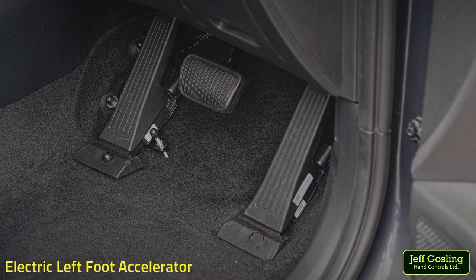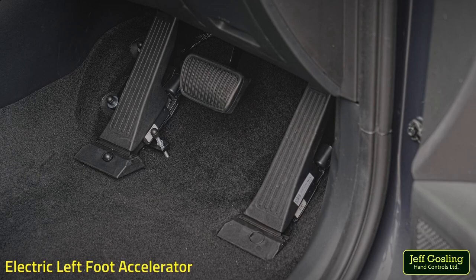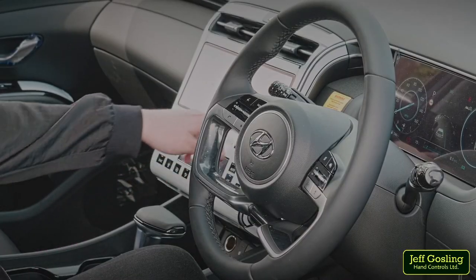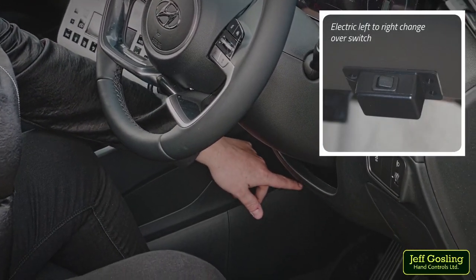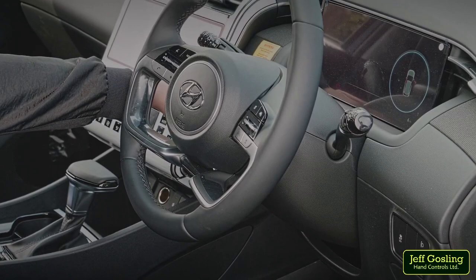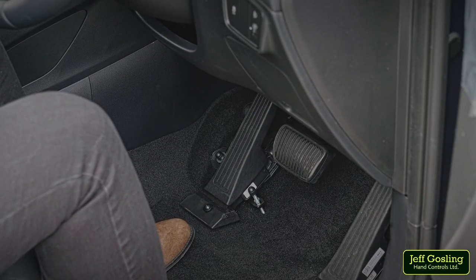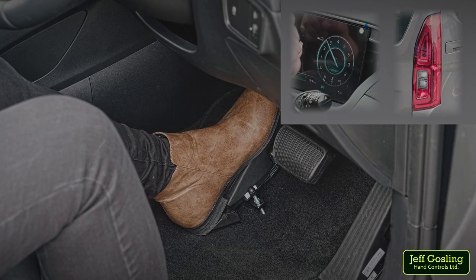The Jeff Gosling electric left foot accelerator replicates the standard right hand side pedal electrically, using an additional OEM accelerator pedal to the left side of the brake pedal. The electric left foot accelerator is simply operated by selecting the required pedal using a changeover switch. The selected pedal is energised whilst the other pedal has no function and can be used as a footrest. This enables the vehicle to be converted easily to drive with either the left or right foot depending on the driver's requirements.